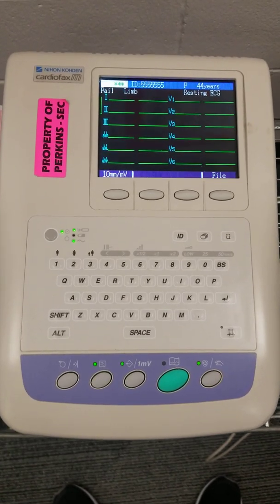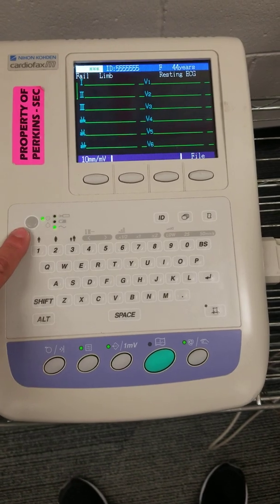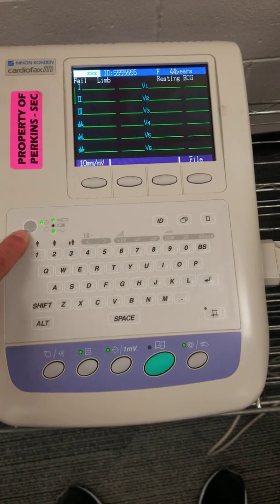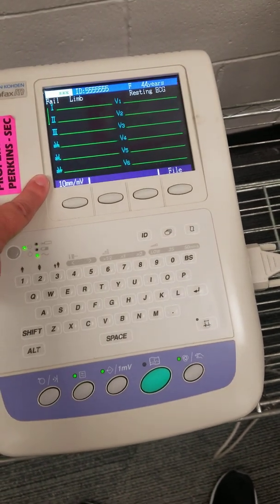This is a demo video of the Nihon Kohden CardioFax M. Some of the things you need to know: this is the on button. When you press the on button, the screen will light up.